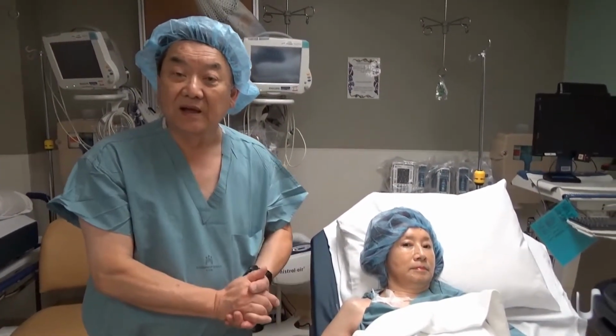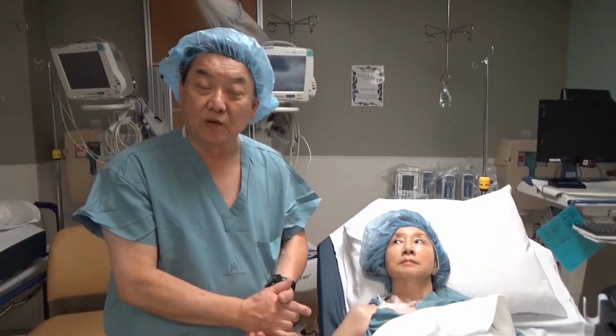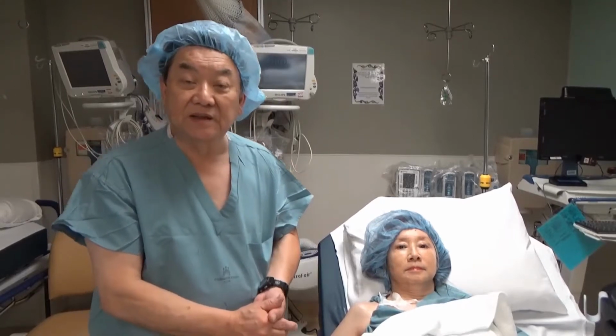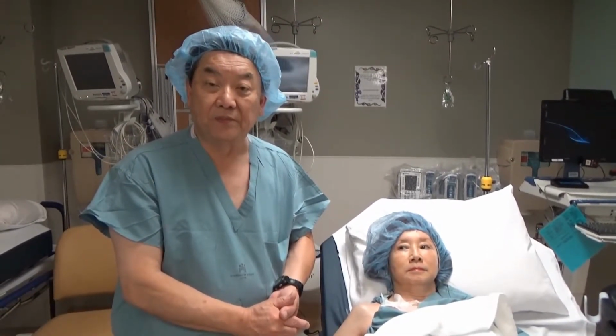So that is the procedure for fenestration, or sometimes called percutaneous needle tenotomy of calcific rotator cuff tendinopathy.